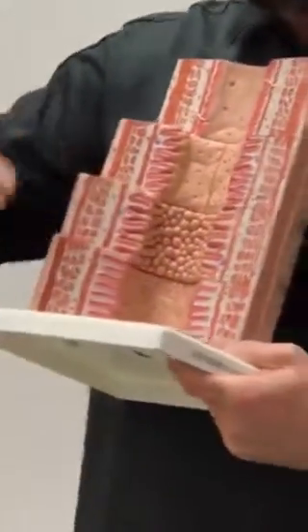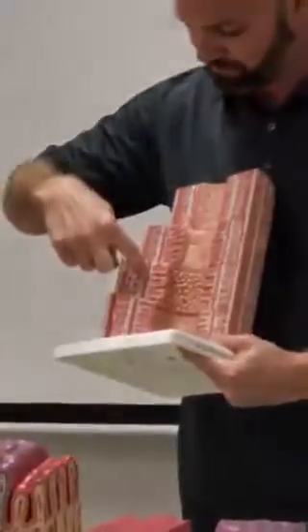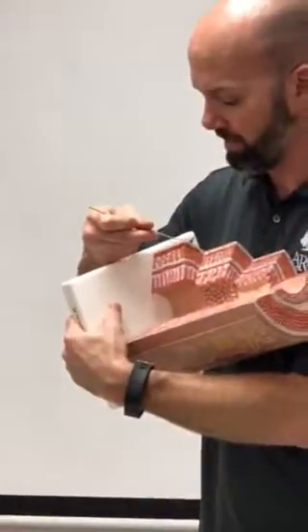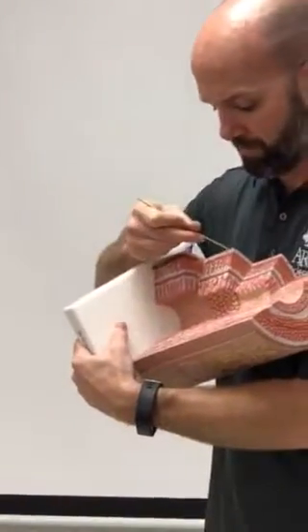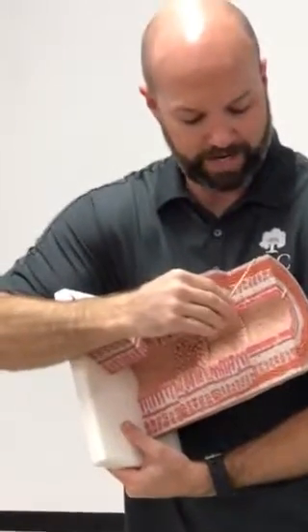And if this is small, then what's this? Large. At least they show more mucosal glands. That's good. What are these purple things here? Yeah, lymphatic follicles. And then as far as the outermost tunic, serosa, serosa, serosa. But here, you're missing that epithelium, so this is adventitia, as it should be. That's esophagus.